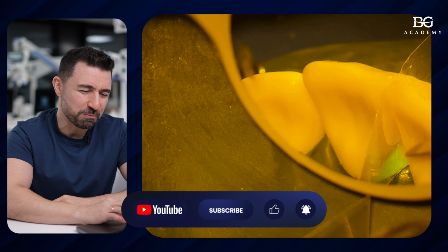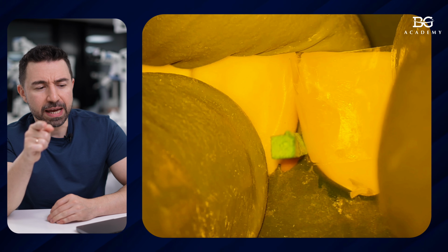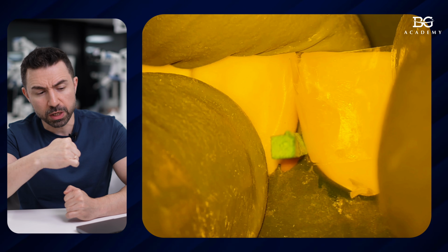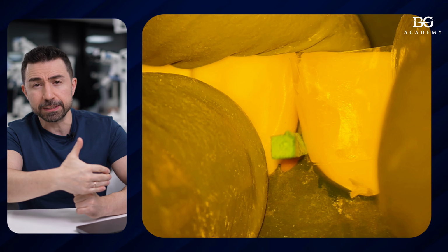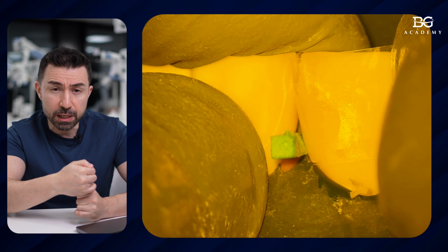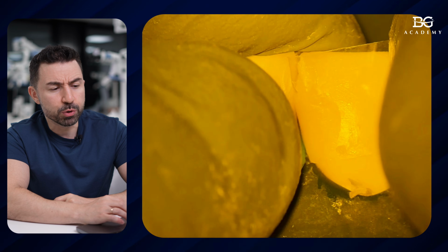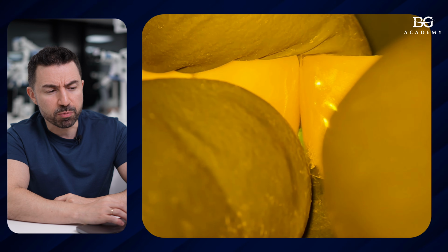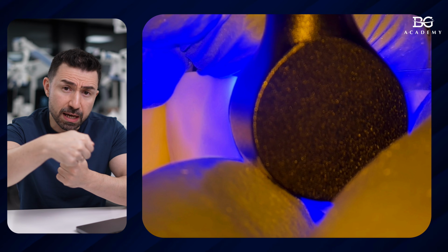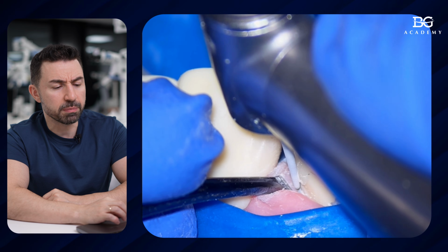And then we continue. So we have composite there. Then I start to manipulate the matrix, by pushing the matrix in the buccal direction and incisal direction. Our composite follows the shape I would like to create. So basically we have to manipulate this matrix in a specific manner, and that will help you to get the exact profile you want. Then you fix it with one hand, another hand, and then you polymerize, okay? Then you will do finishing and polishing.